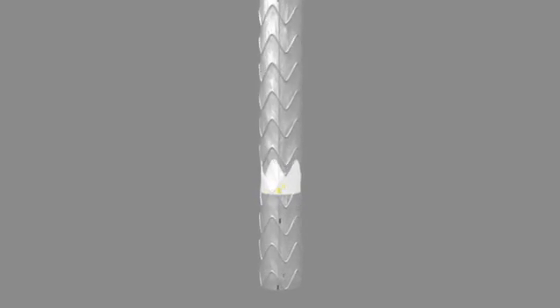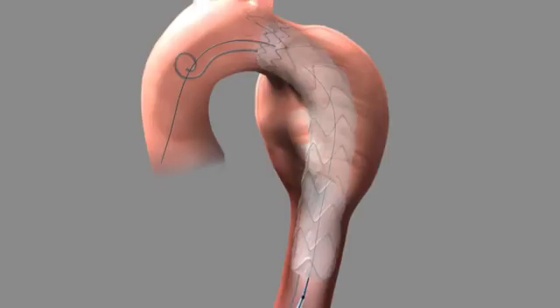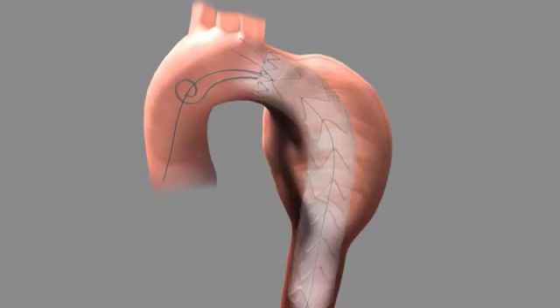Radiographically verify that the proximal figure-8 markers are aligned with the distal markers of the mating graft and that the connecting bar is oriented toward the outer curve of the vessel. The Reliant stent graft balloon catheter may be used to remove wrinkles and folds from the graft material and model the graft to the vessel wall.